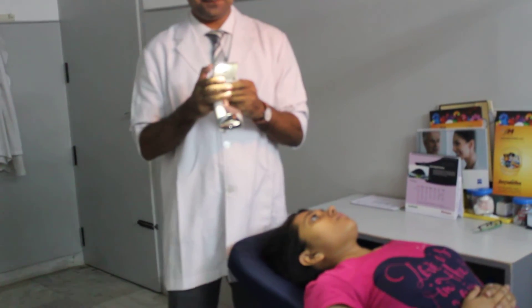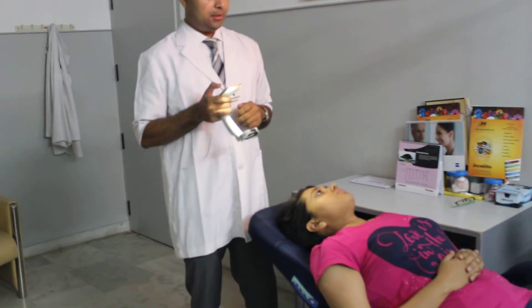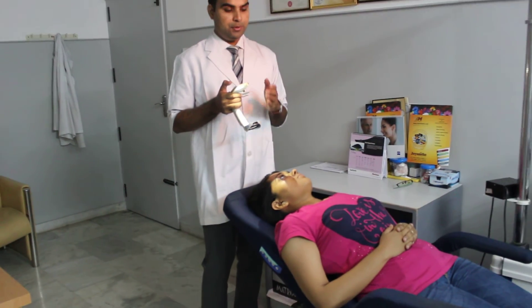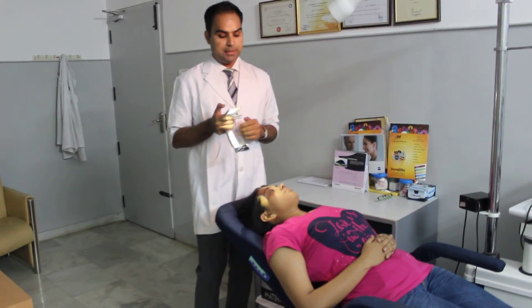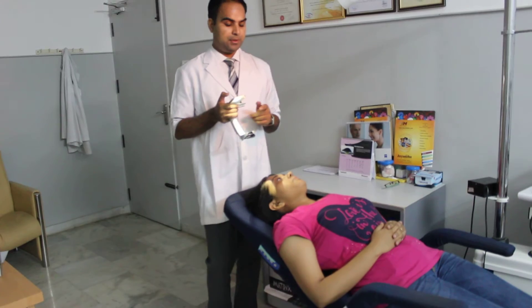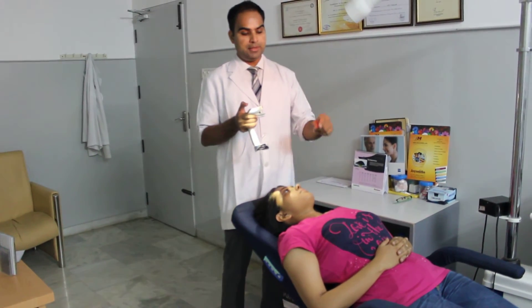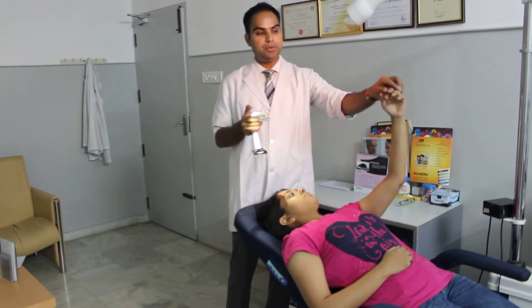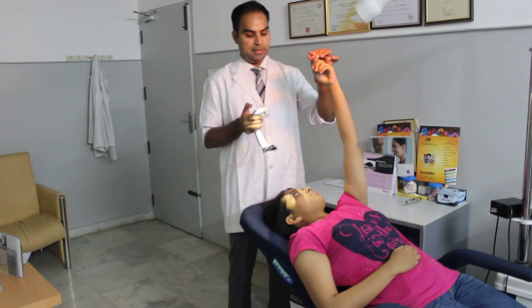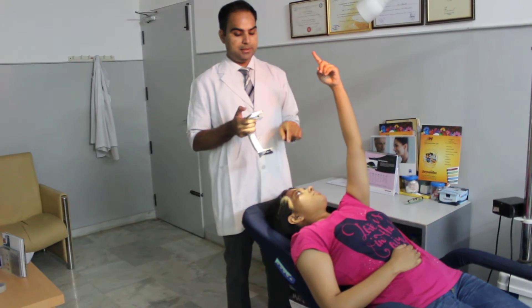What we are going to do is scan your right eye first. For the right eye, we need your left hand so that you can look at your left hand with your left eye.